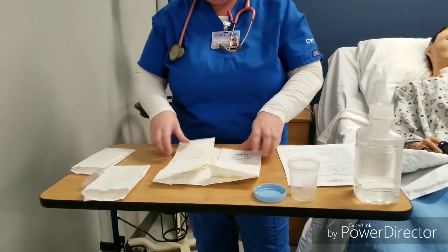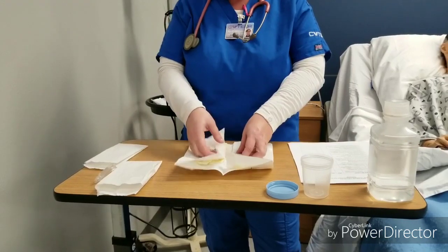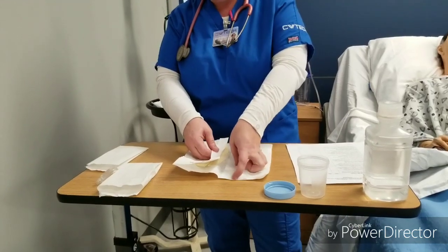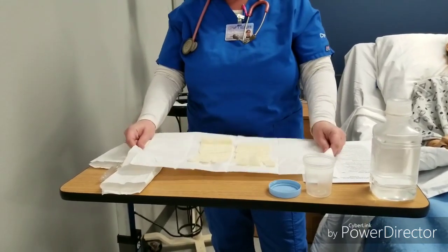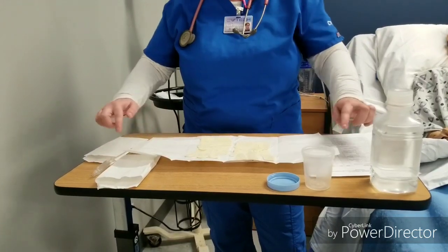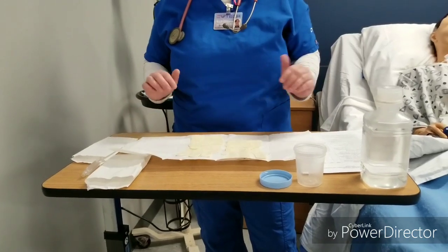Make sure you get these flat so it's easier to use. And you have a 1-inch border around your paper that you can sometimes use. A little difficult to fit and pull and straight. I can go 1 inch around, but I do not want to touch anything in the middle, because all of that's sterile.